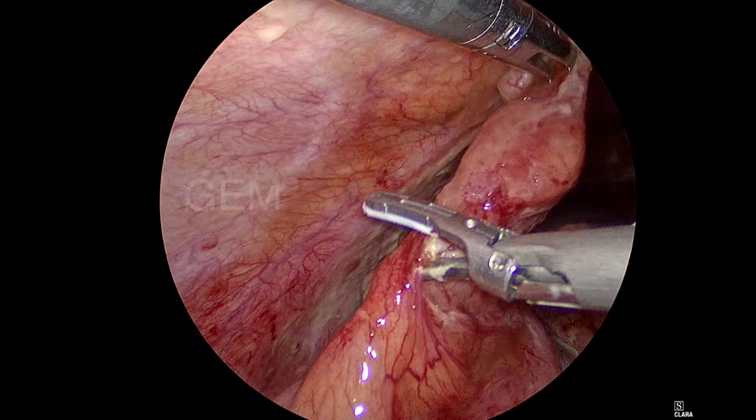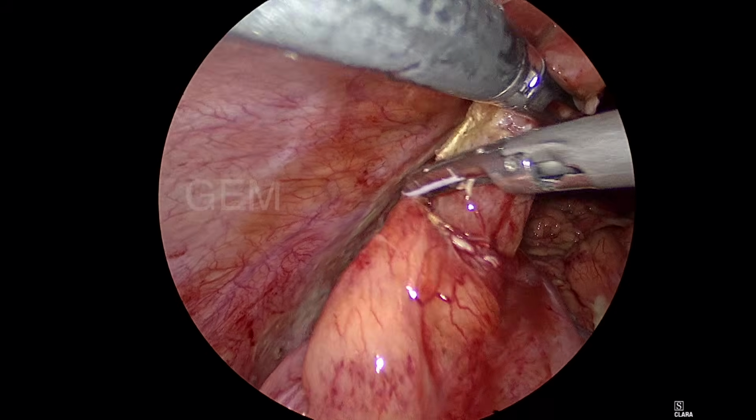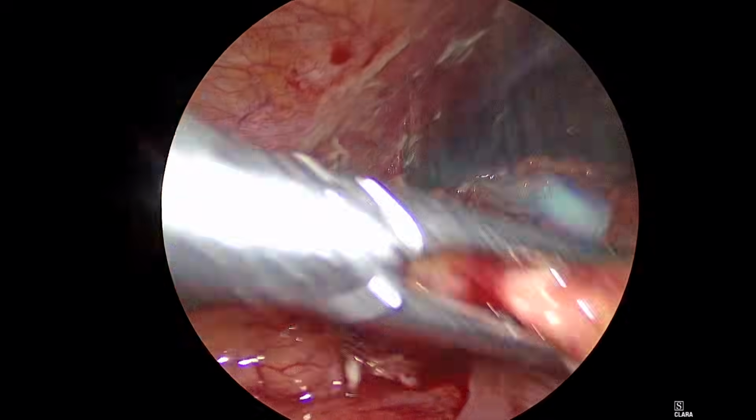tackle with this port. I think this is the 9th or 10th video I am uploading. In all cases I am using only this port. Only for the pelvic position I do a different position, different port. Otherwise all appendices I could manage with this port.